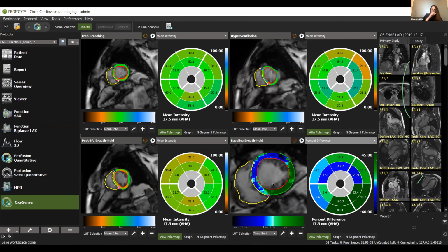And then, with our other publications, the Circulation Research letter where we talk about the regional heterogeneity and ANOCA, those are just different coded biomarkers. So it's just different calculations, but all based off of the same data and just looking at the dynamic changes in the signal intensity a little bit differently.